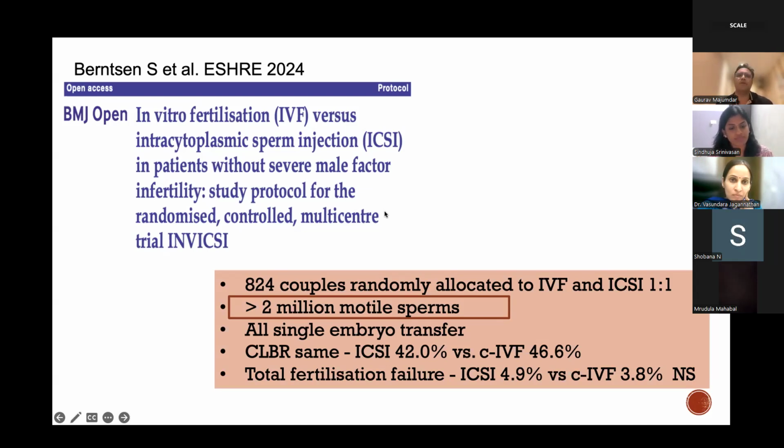Only if the cumulus is huge, very big. Otherwise, we generally don't. We remove cumulus if there's a lot of blood attached to it, or if the cumulus is very unhealthy looking or post mature, then we may just want to trim it. If the cumulus looks post mature, then you should inseminate as soon as possible and not wait, because otherwise we wait for a minimum of 3 hours before doing either IVF or ICSI.